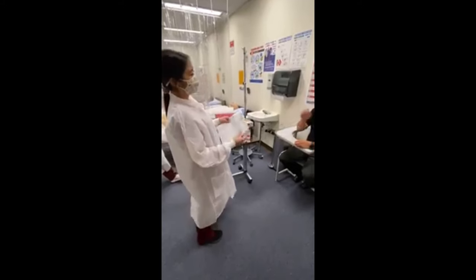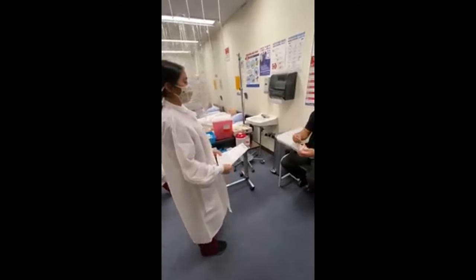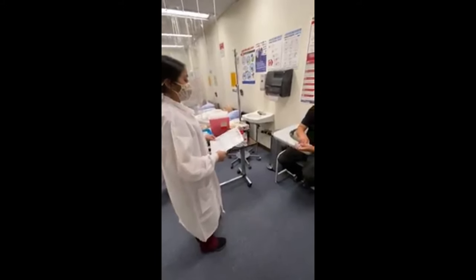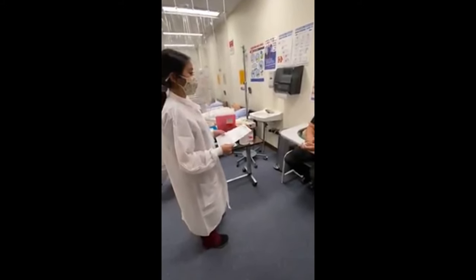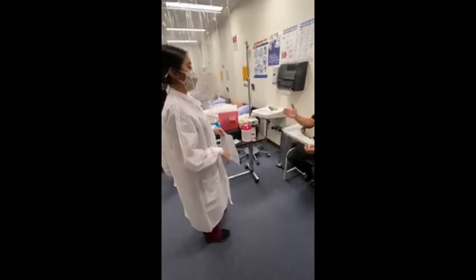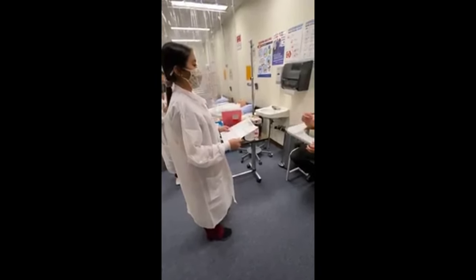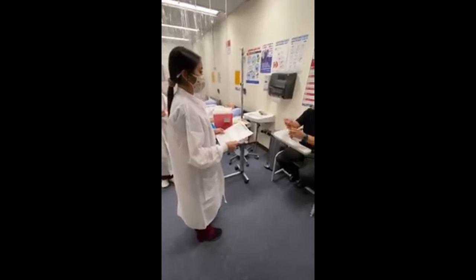I don't know, ask another person. Yes, exactly. So exactly what you said, you would verify the correct patient. I would go to the tech who gave them and say, this patient is not what they're saying it is. Can you verify this is the one? Maybe I have the wrong sheet. Okay. Usually if it's printed out, it's on the hospital end. Oh, so they would verify it and then give you the right one usually. Okay. So let's say you have the right one.